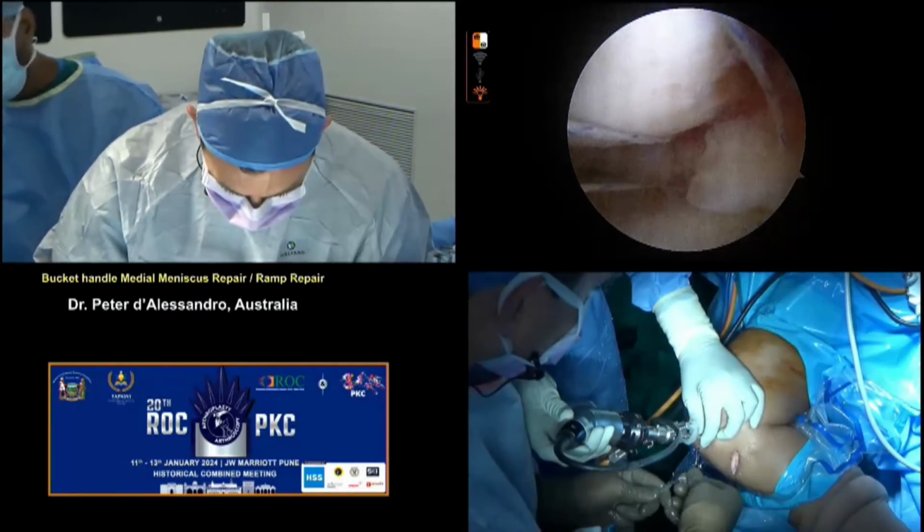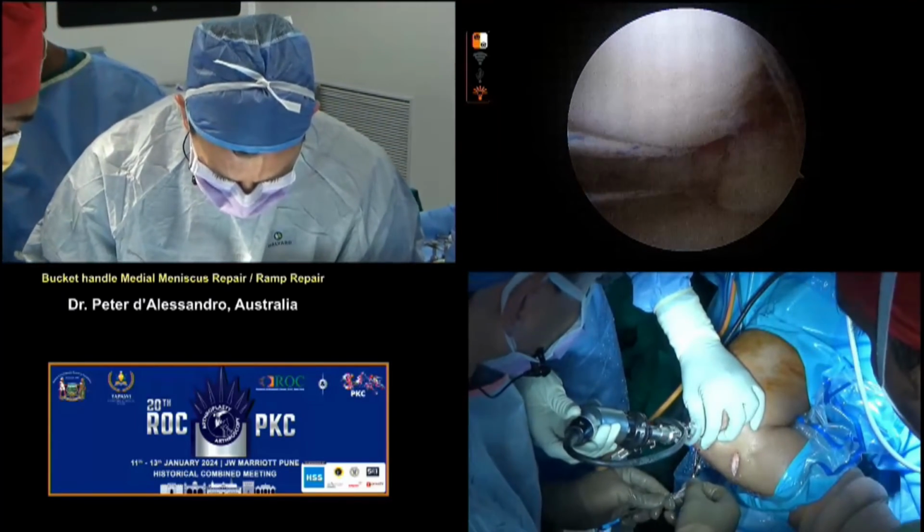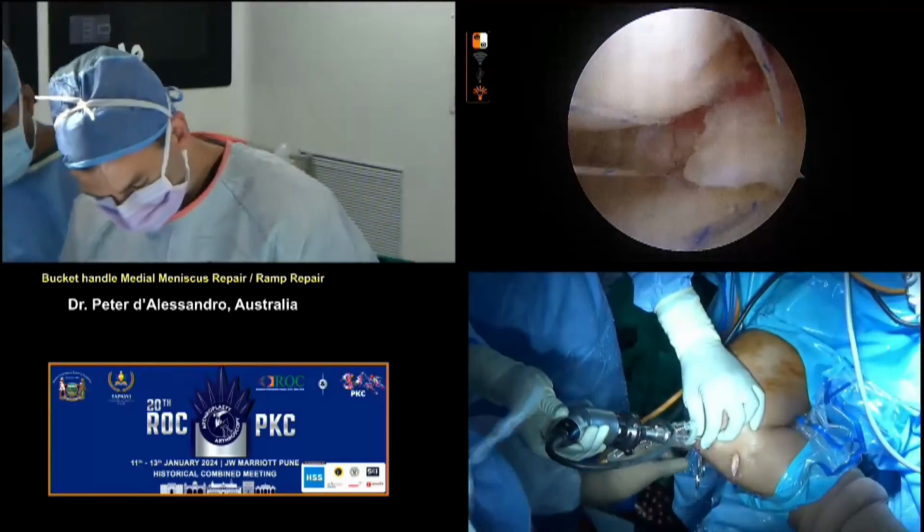We're just having an issue here where that appears to be a bit stuck on our Nova stitch. What's that? Just pull it. Sorry, Peter, I know you're in the thought process there, but could you clarify a little bit?